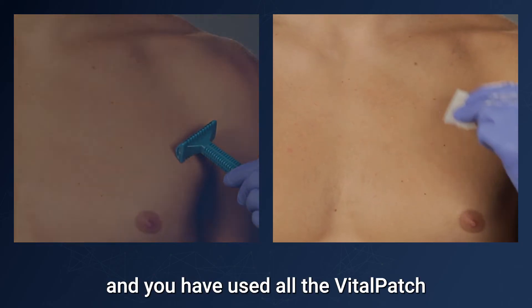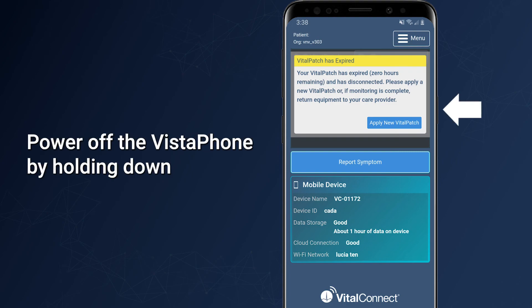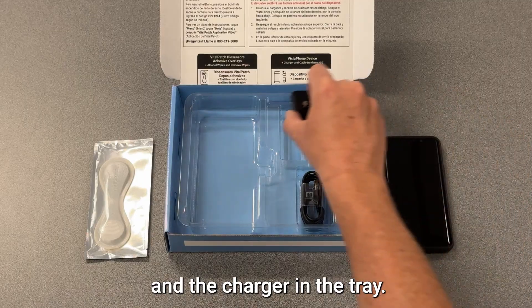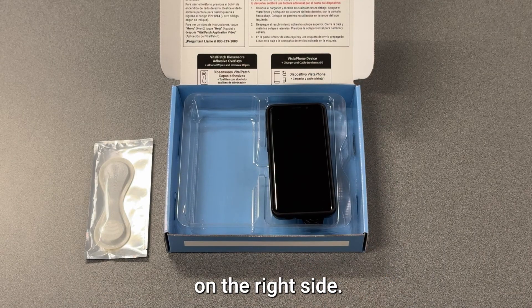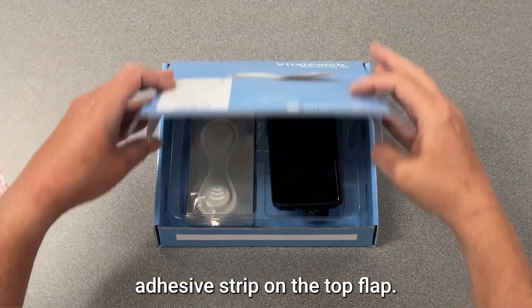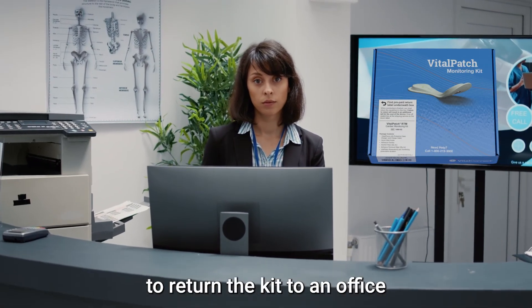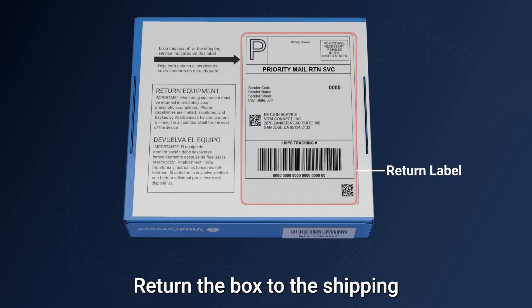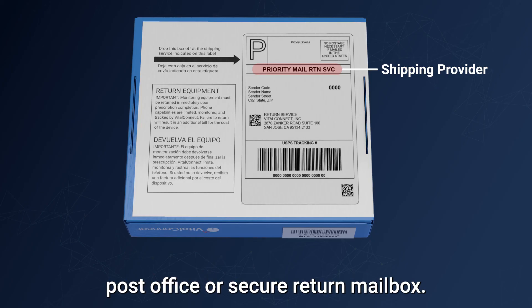If your monitoring period is complete and you have used all the Vital Patch devices provided in your kit, you must return the equipment. Power off the Vistaphone by holding down the power button and tapping Power Off. Place the charging cable and charger in the tray — in the small slots on the right or the large compartment on the left. Place the Vistaphone in the slot on the right side. If you have unused Vital Patch devices, place them in the slot on the left side. Peel off the protective layer from the adhesive strip on the top flap, fold the top flap down, tuck in the side flaps, and press the flap down to seal the box. If returning to an office, do so as soon as possible. Otherwise, flip the box over, locate the return label, and return the box to the shipping provider shown on the label — for example, if the label says Priority Mail, drop it off at any post office or secure return mailbox. Note that if you do not return the equipment, you will be charged a replacement fee.